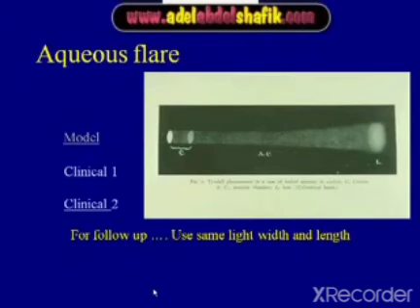It is important for follow-up of cases to use the same length and the same width of the beam.